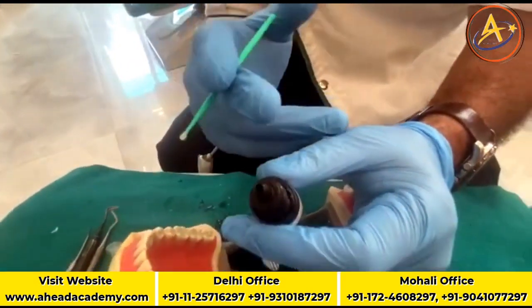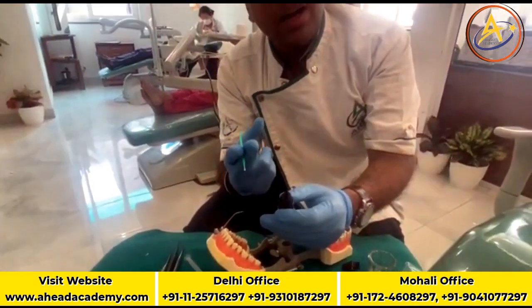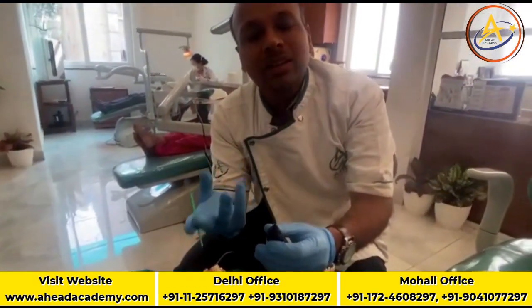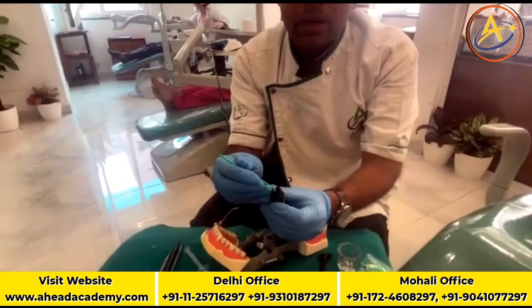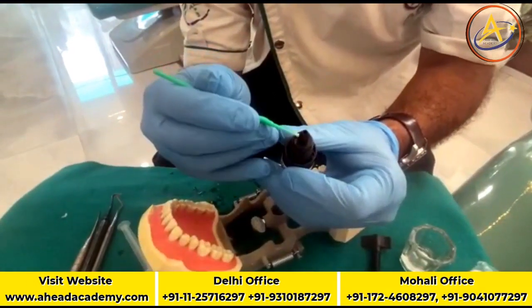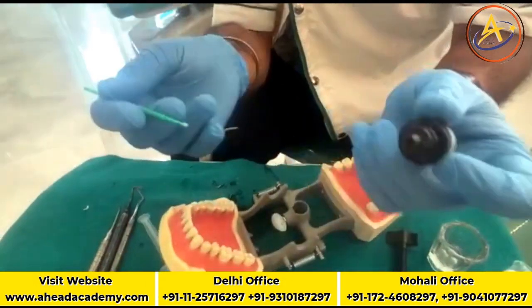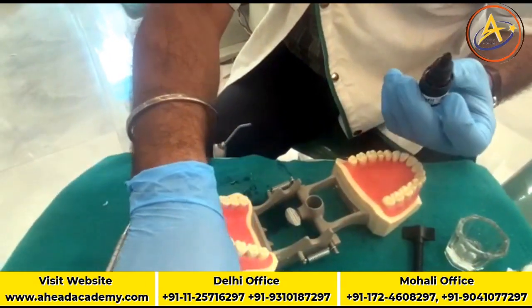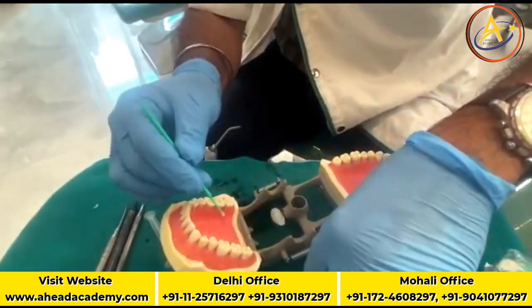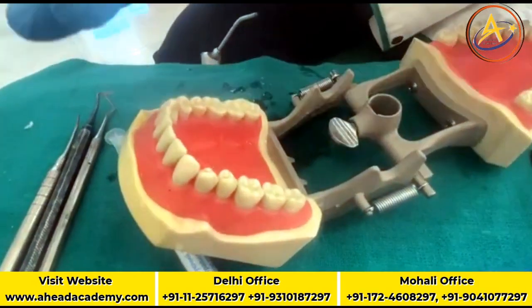Why? Bonding agent consists of two things. One is alcohol, which is basically the solvent, and the other thing is resin. The bonding agent which is left on the sides of the bottle contains only resin. It does not contain any kind of solvent, so this results in deterioration of the bonding agent. So always take a drop from the bottle, apply it onto the tooth surface, massage it, and leave it for 1 minute.